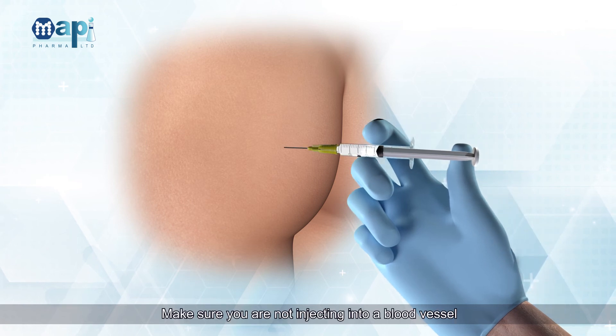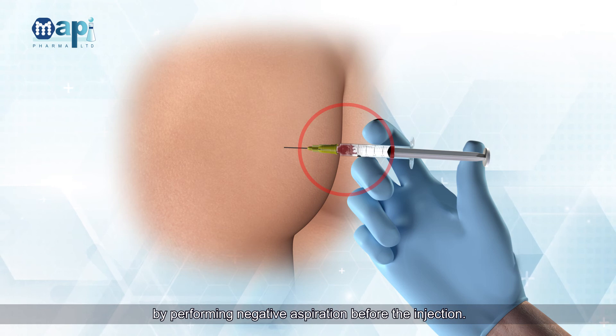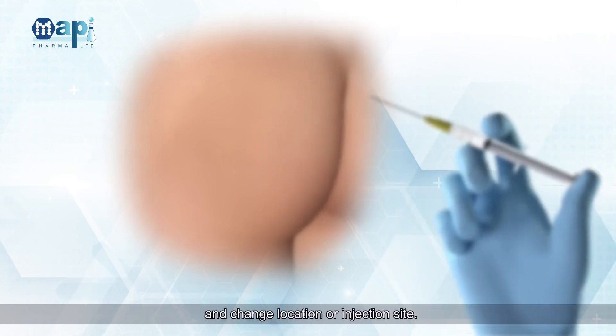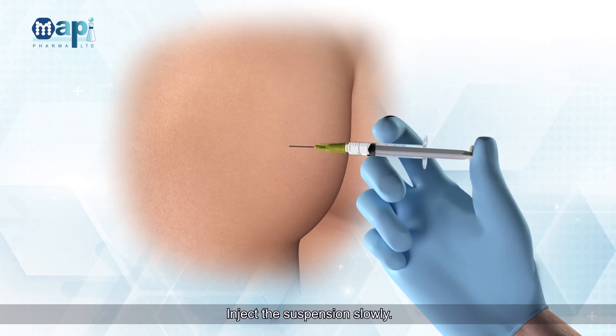Make sure you are not injecting into a blood vessel by performing negative aspiration before the injection. If blood is drawn, change to a new 20 Gauge injection needle and change location or injection site. Inject the suspension slowly.